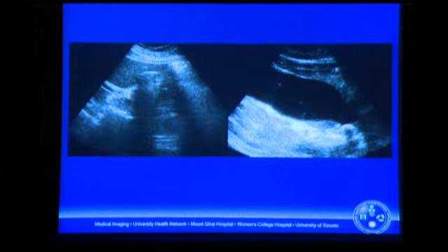This was an elderly woman who had emigrated from Vietnam who presented one morning with projectile vomiting. And this again was the very best image we could get of the gallbladder fossa, which showed gas with reverberation artifact. And immediately next door was this highly dilated peristalsing tubular structure with a stone within it.